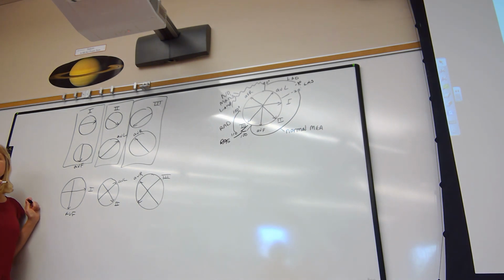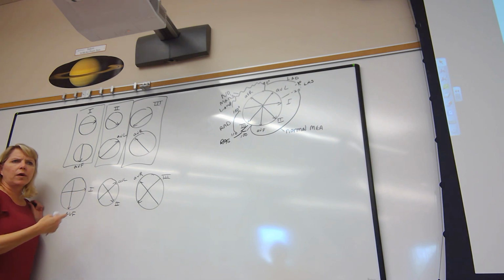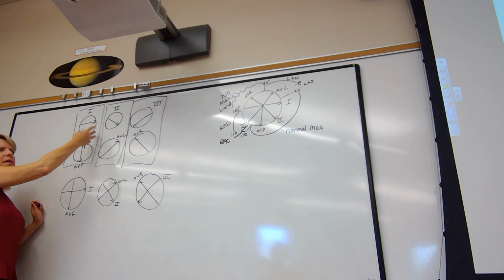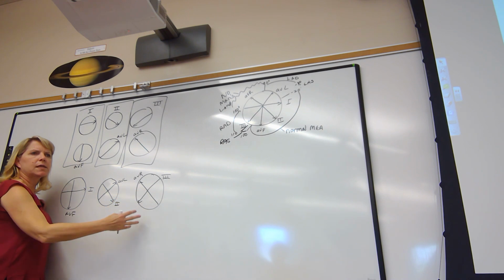Someone from your class last night said, Kara, I can think of another two leads put together where I get a circle cut in equal fourths. I said, you're awesome. Then good for you. You get this. But this is the combination I will use on Tuesday's exam.